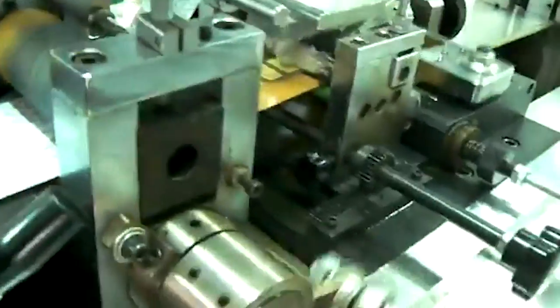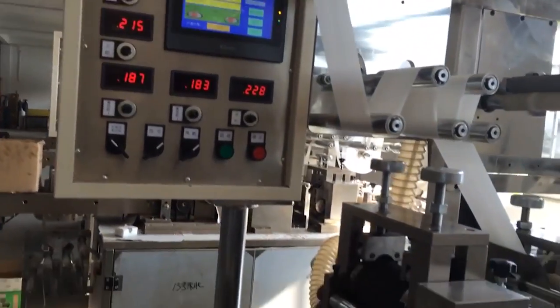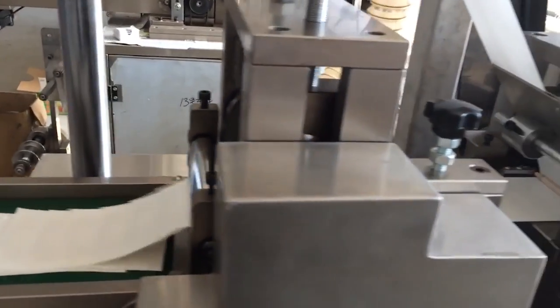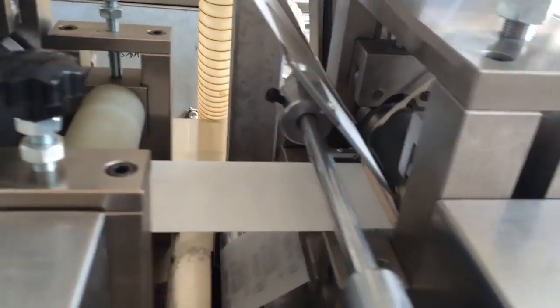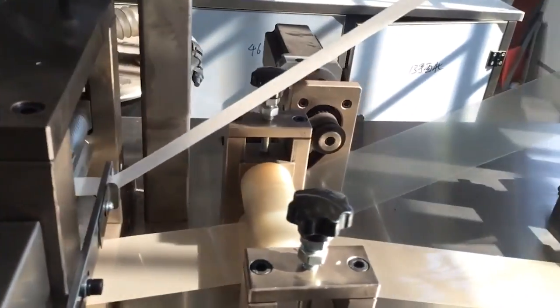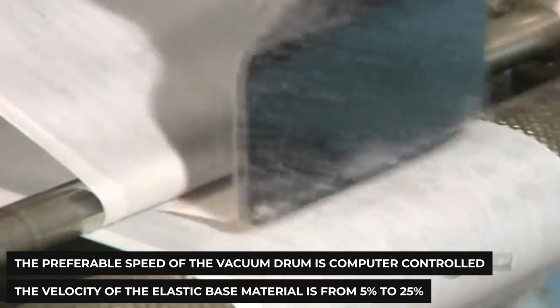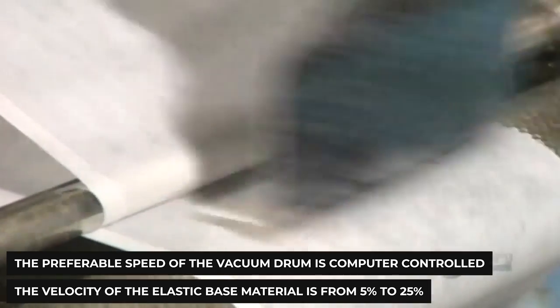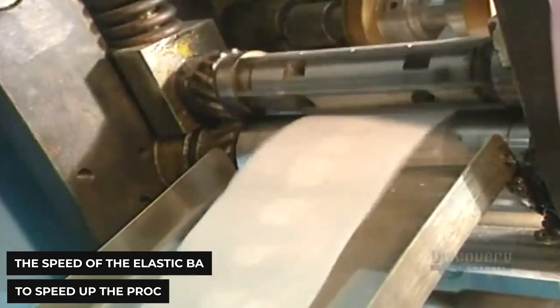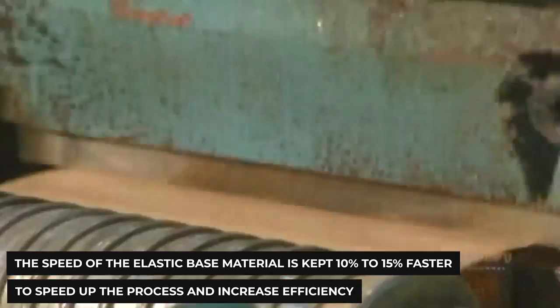The speed of the bandage rolls should be computer-controlled to supply the necessary velocity and control to the composite material making up the bandage. This is a crucial step because without proper machinery and technique, the resultant bandages will either not be cut to the appropriate size or not have sufficient elasticity to conform to the wound area. The preferable speed of the vacuum drum is computer-controlled, and the velocity of the elastic base material is from 5% to 25% faster than the velocity of the other materials. More preferably, the speed of the elastic base material is kept 10% to 15% faster to increase efficiency.